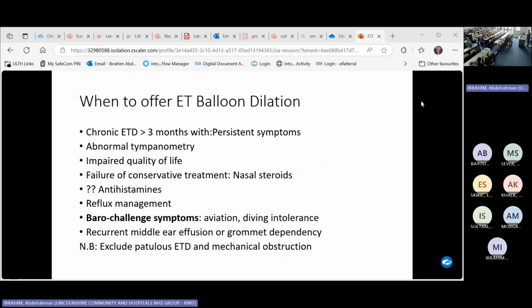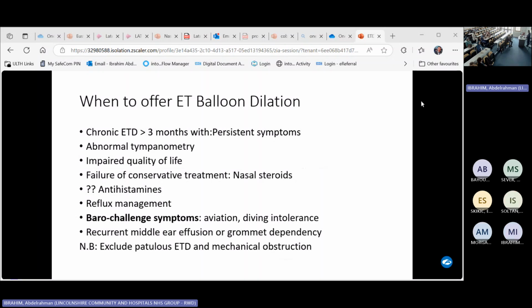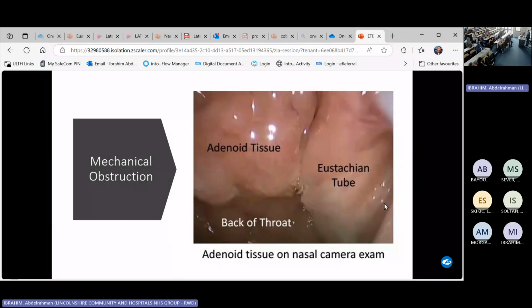Of course, we need to exclude that this is a patulous Eustachian tube, and we need to have a look inside if there is any mechanical obstruction. So yeah, we need to have a look if this is adenoid tissue or Eustachian tube. We look inside this patient. First, I need to fix his Eustachian tube and see if I will do Eustachian balloon dilatation in the same sitting or another sitting after that. But actually, this patient, if you do the adenoids for him, you change his life just by doing the adenoids.